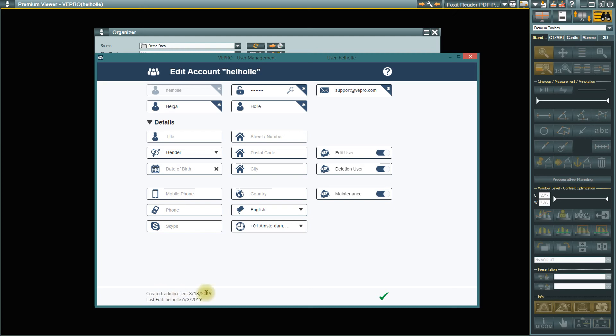At the bottom edge, you will see who created the profile or made the last change. You can find out the User Management version number via the question mark.